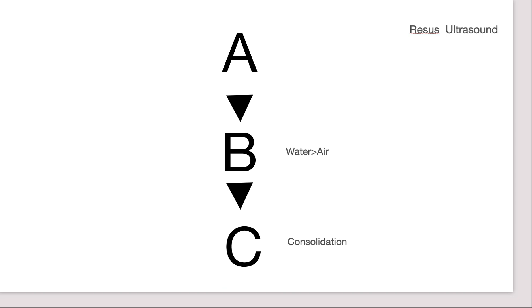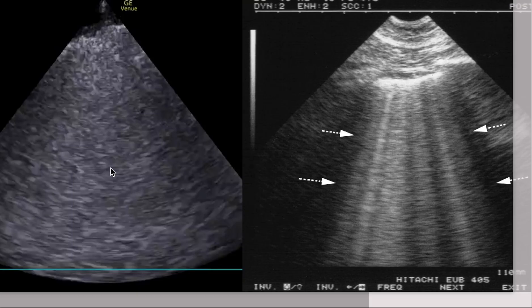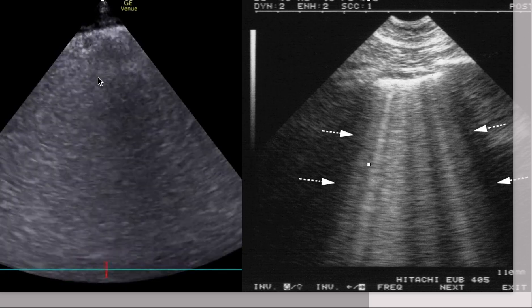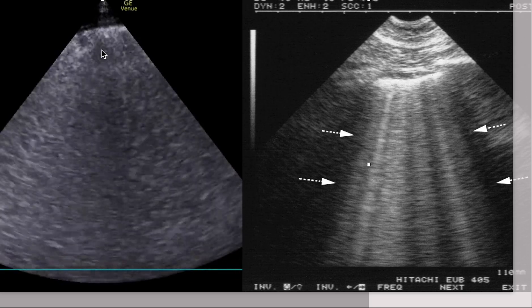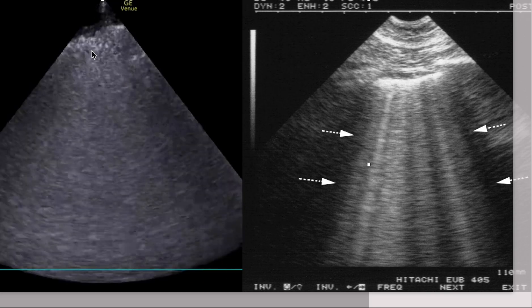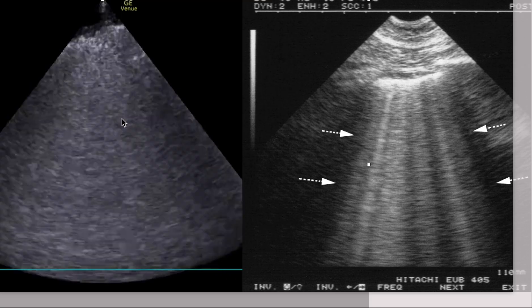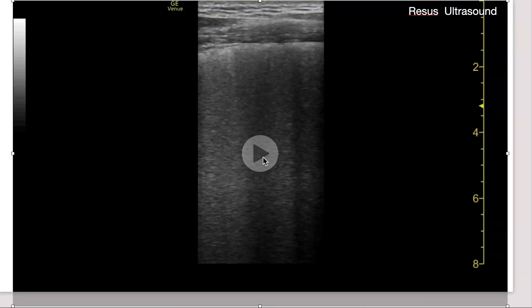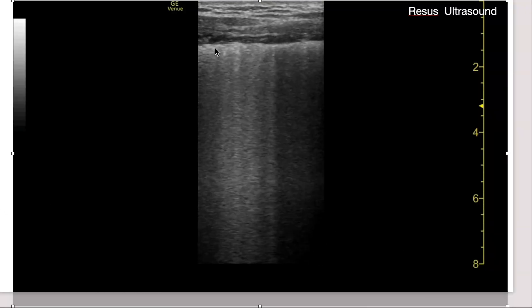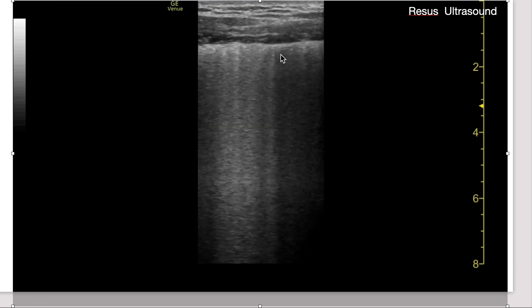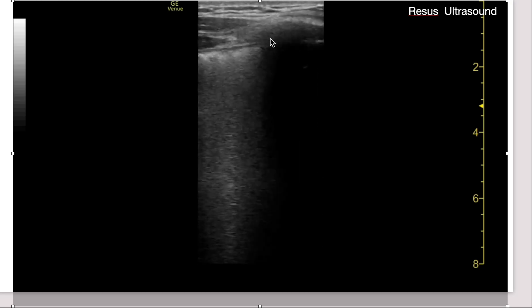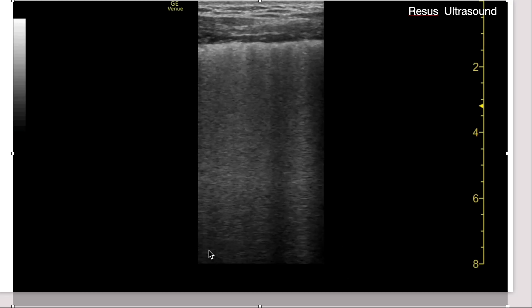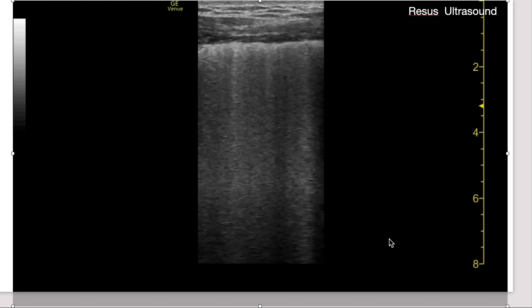In this patient — a real case — you can see there are no A-lines anymore. It looks white, you can maybe see B-lines, and there is some kind of black area. There is an irregular pleural line. I changed to the vascular probe, and you can see the pleural line is thickening — normally more than two millimeters — with a lot of B-lines, but they are not regular.